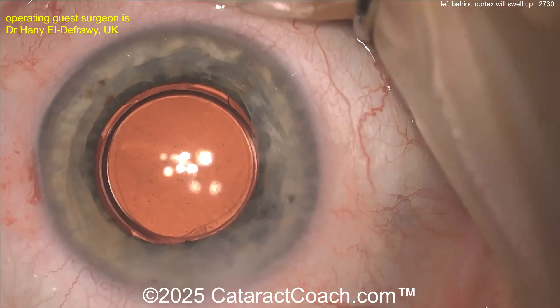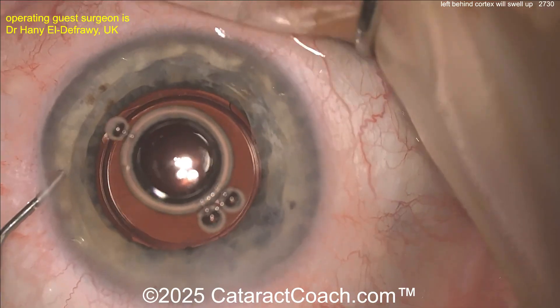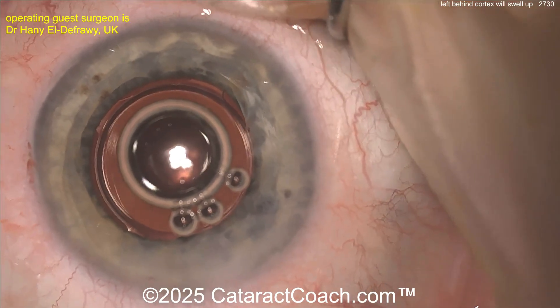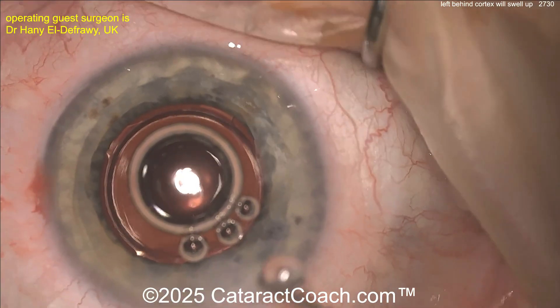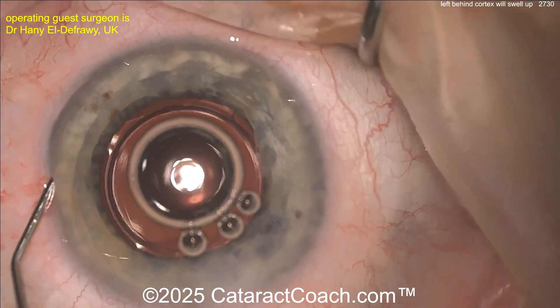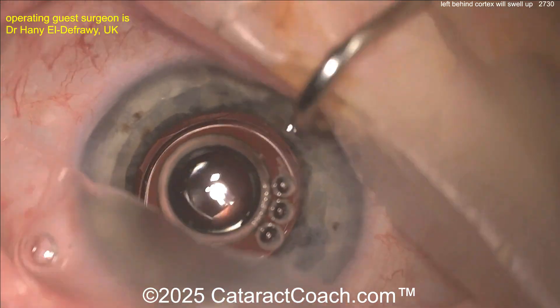If you see a patient of yours with some residual lens material on post-op day one, it's okay — just take them back to the operating room. I know it's a stretch, but go back, clean it up, and you and the patient will both be happy. What a beautiful result — the air bubbles will resolve with time, that's no big deal.